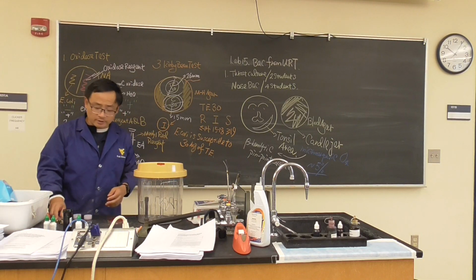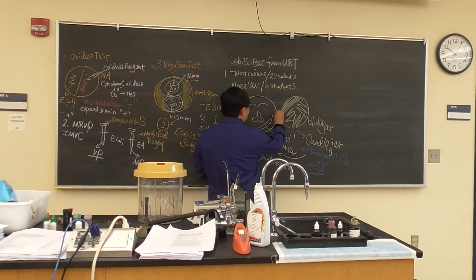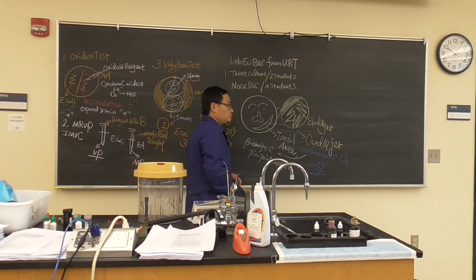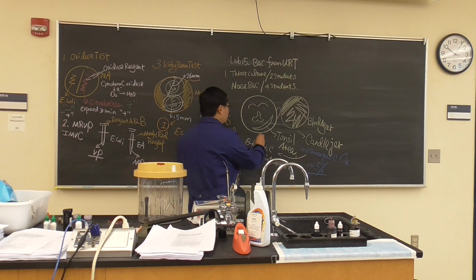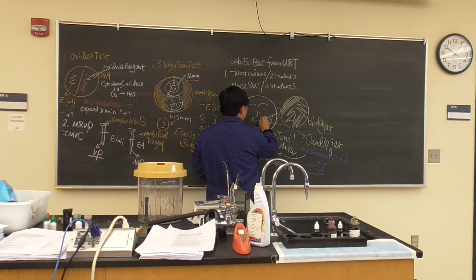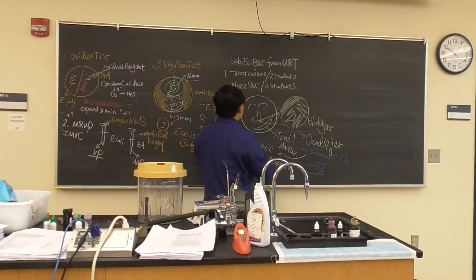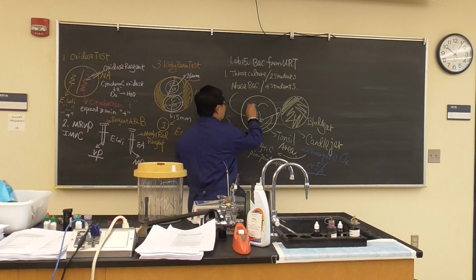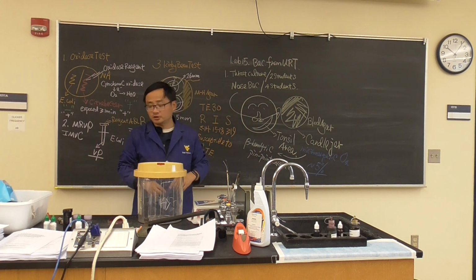Now we also want to make it fun this year, because remember we talked about the nasopharyngeal swab. I don't have it. And we talked about the half distance between the earlobe and the nose. So you're going to do the same thing. That will be you pick from the nose. That's 4 of you together. One of them is a patient.